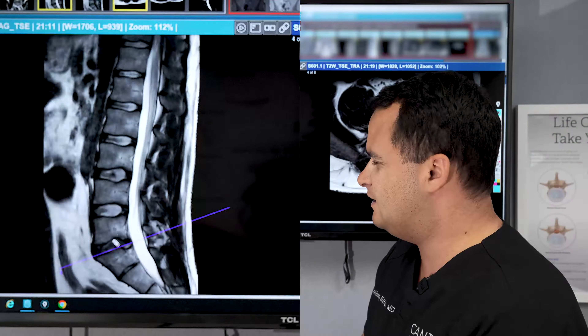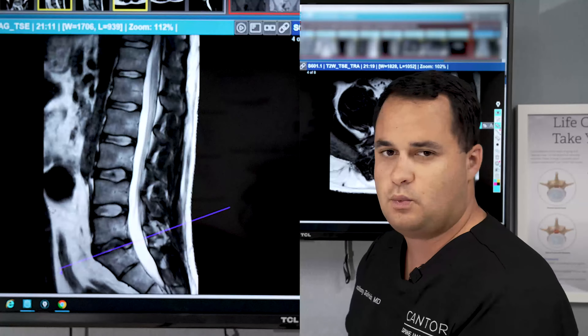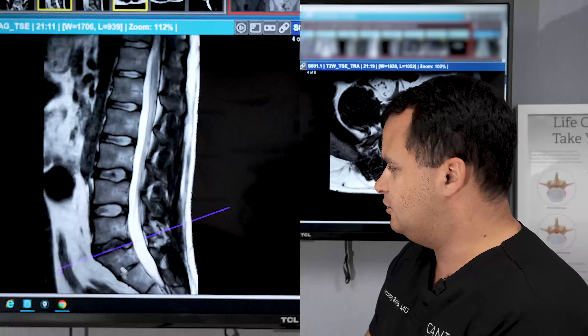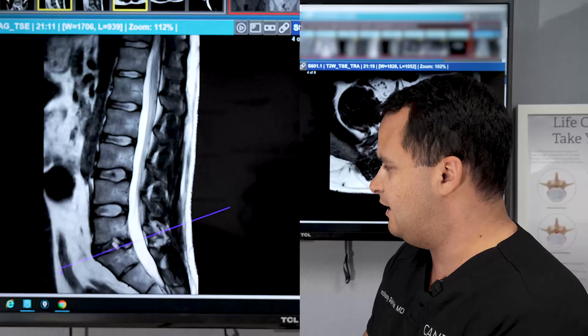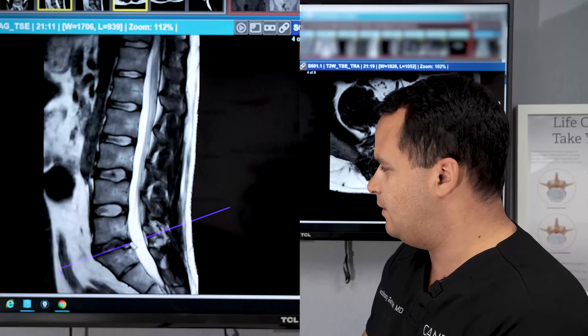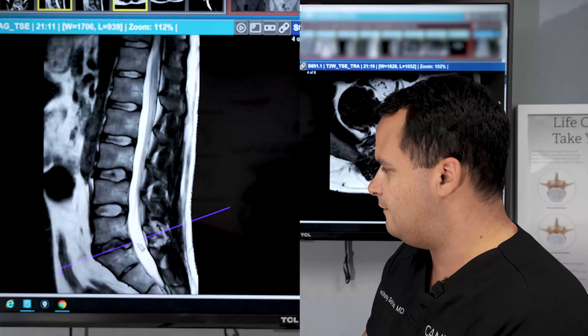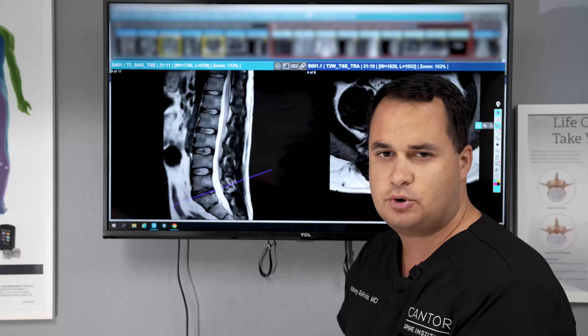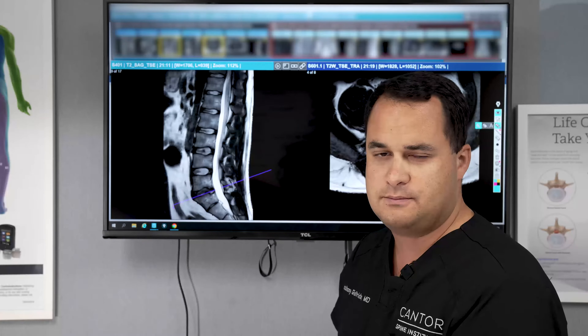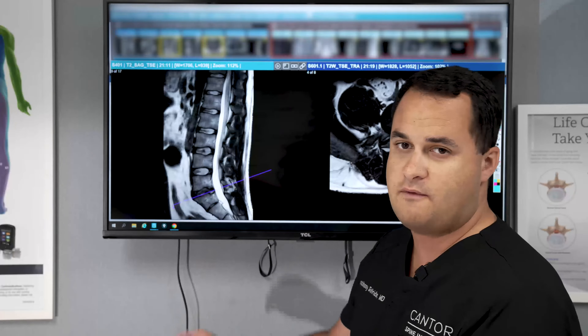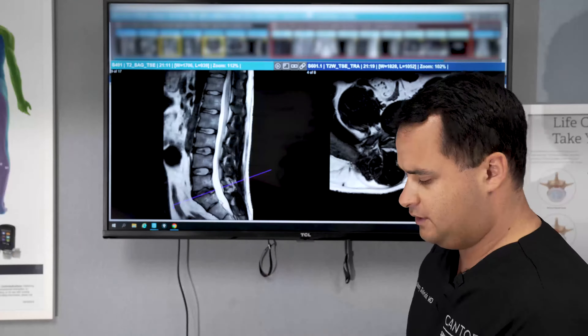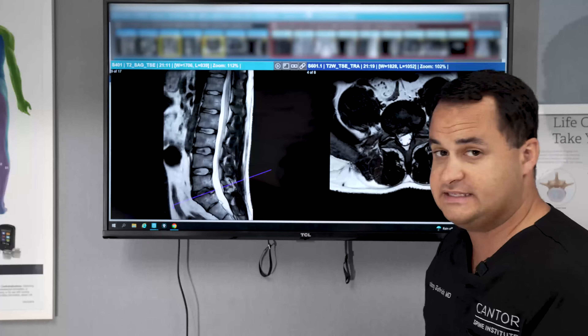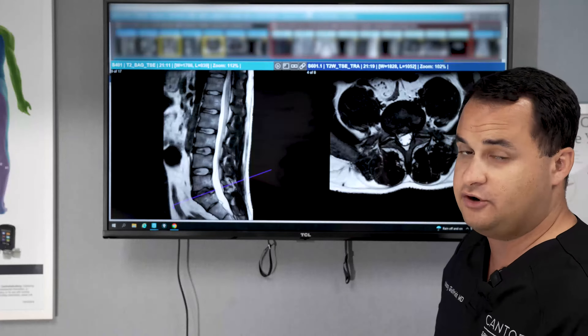When we get down to this L5-S1 disc, we notice there's a little bit of irregularity. But when we look into the canal, there's not much going on — not much bulging, not much compression. So we're going to come over to the axial view and see if we're pushing on any of the nerves.